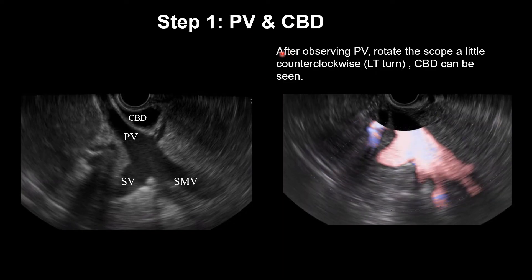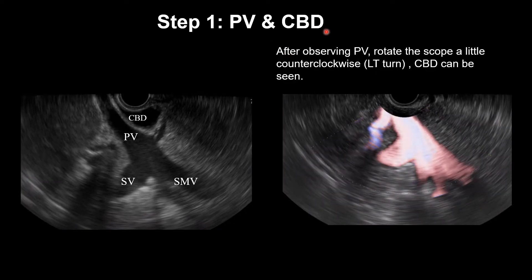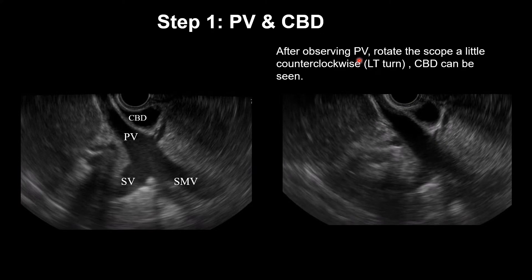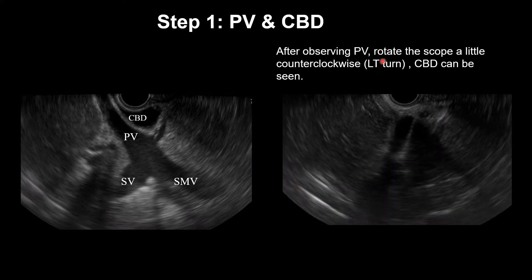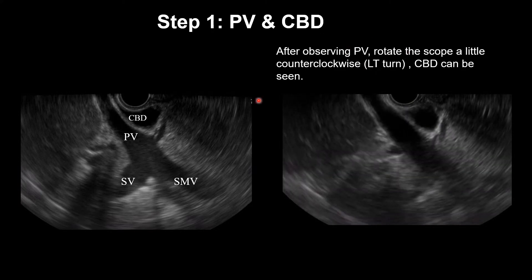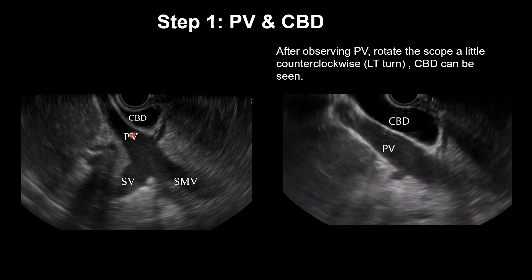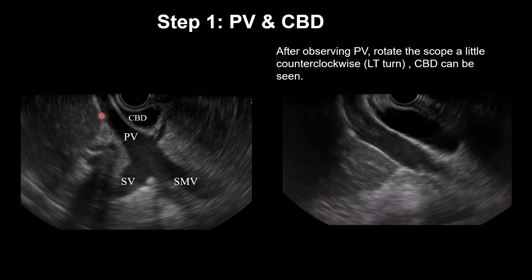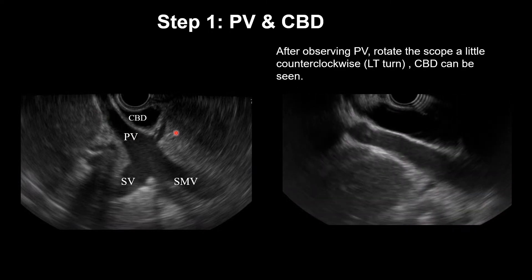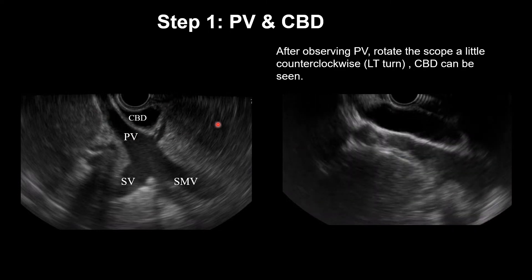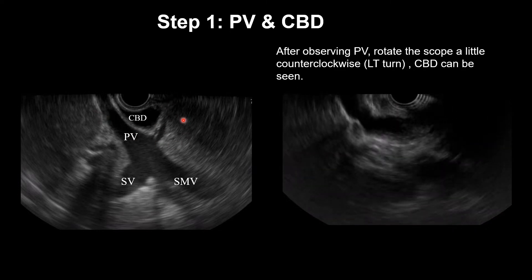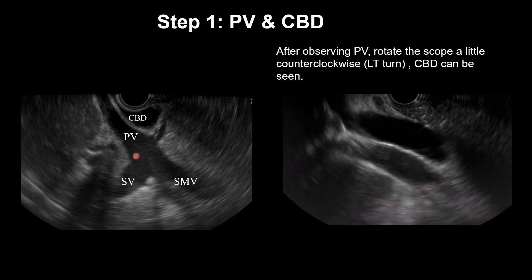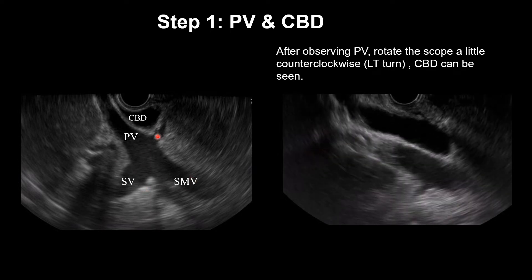Step 1: portal vein and CBD. After observing the portal vein, rotate the scope a little counterclockwise. The CBD can be seen. This area is the pancreatic head area. This area shows the splenic vein and SMV.